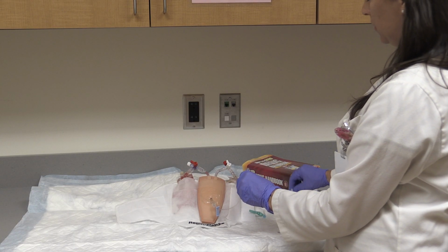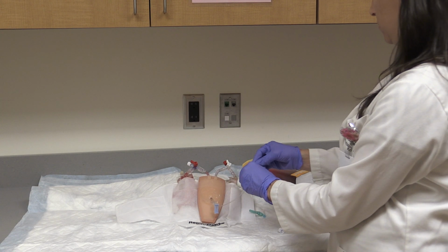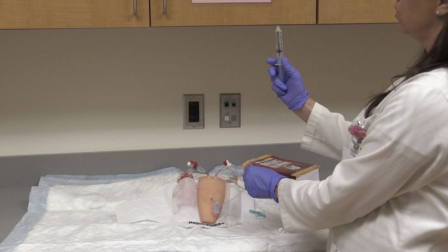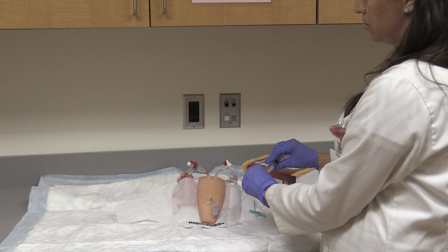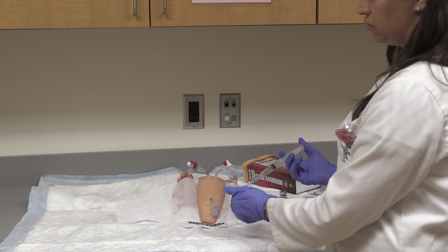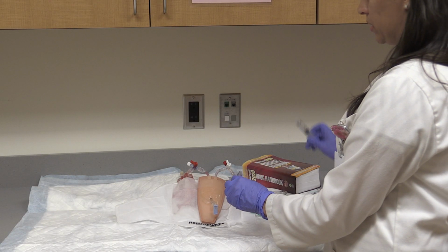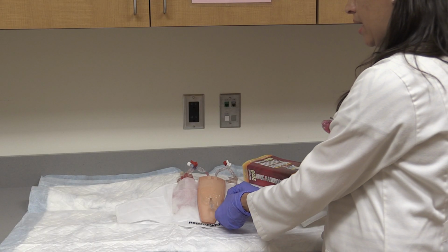Disconnect it. Cleanse the site again with another alcohol swab. Get another saline flush. Take the cap off. Get the air out. Again, flush for 2 mLs. Again, that just is flushing the rest of the remaining morphine into the vein. So once that's done, you want to clamp the line again.